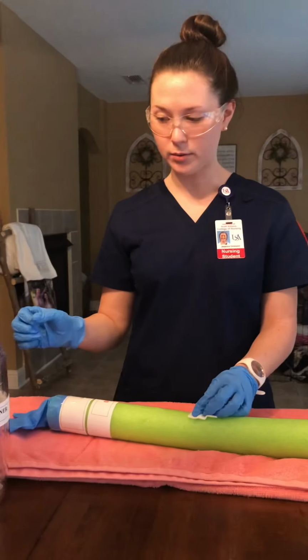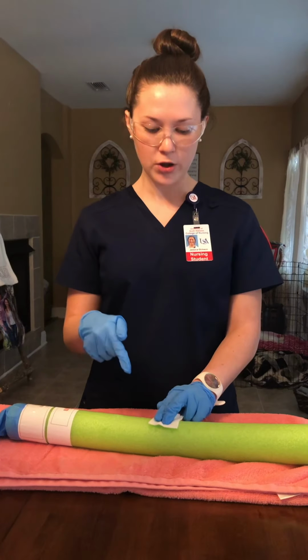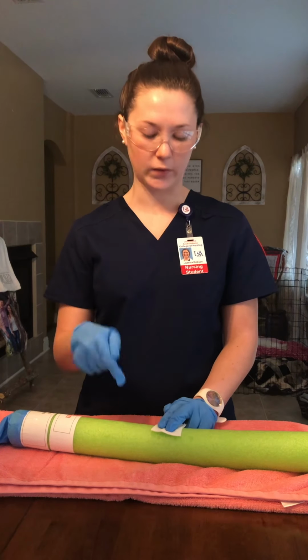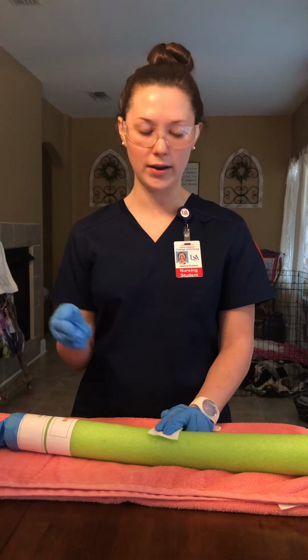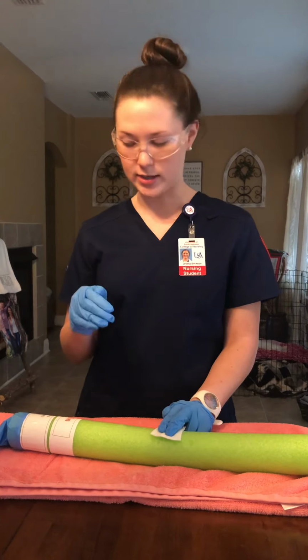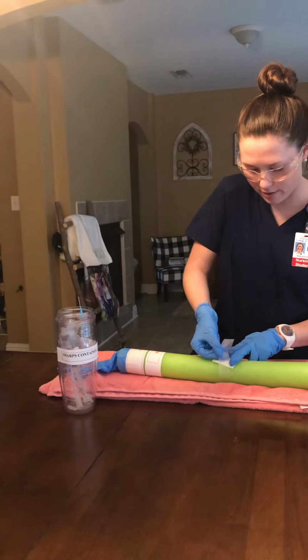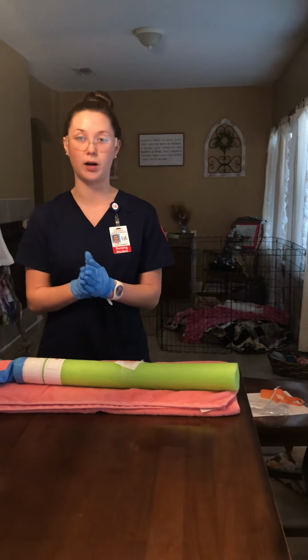So the next thing I would do is hold pressure for at least 30 seconds, just to stop the bleeding. And I would need to be observing the site for pain, tenderness, or redness, as well as swelling, drainage, or bleeding. So once that is done, I'm going to have a clean, sterile gauze, and then I'm going to tape it on there. And this completes my check-off.